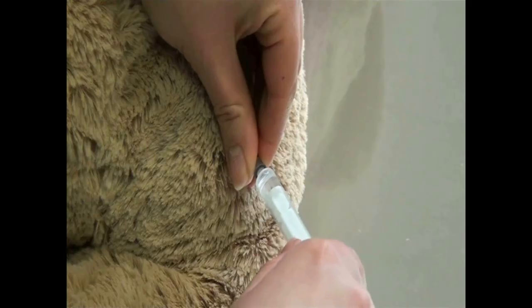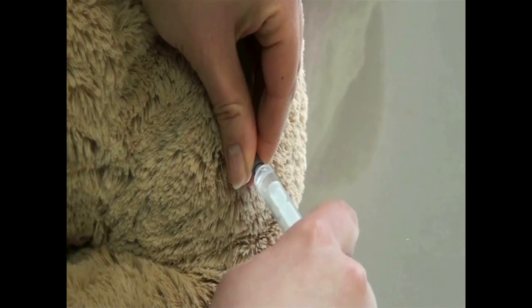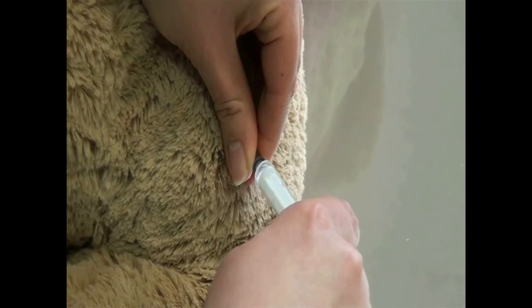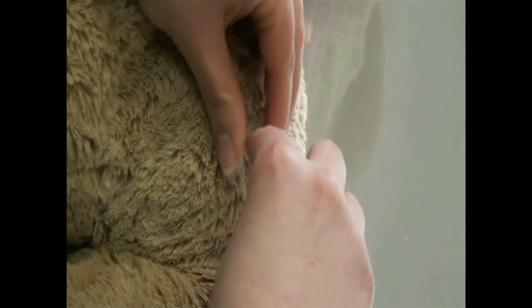Secure the hub of the needle with your fingers and inject the solution. Inject slowly. Afterwards, remove the needle and syringe smoothly and quickly.